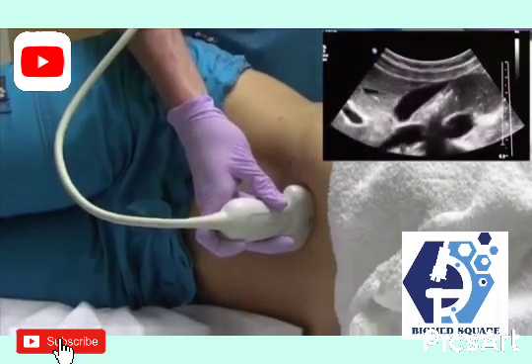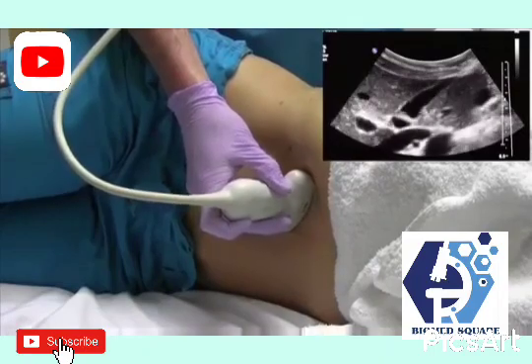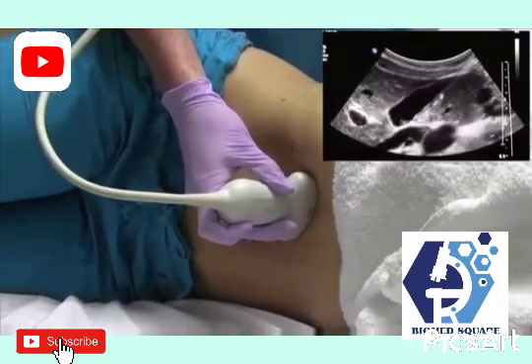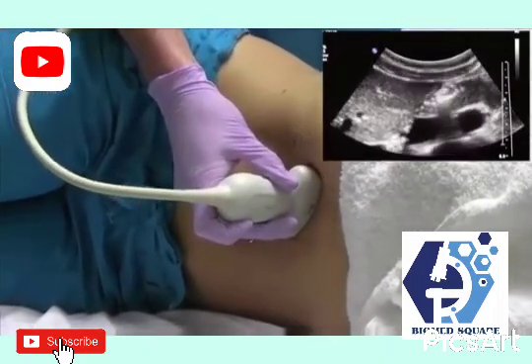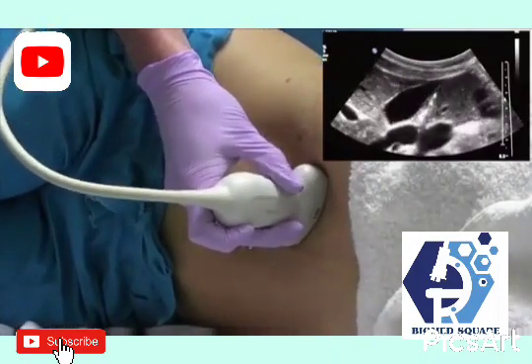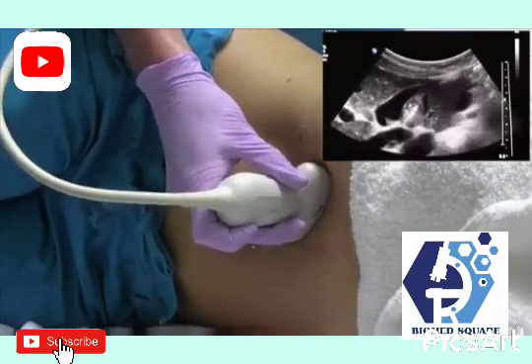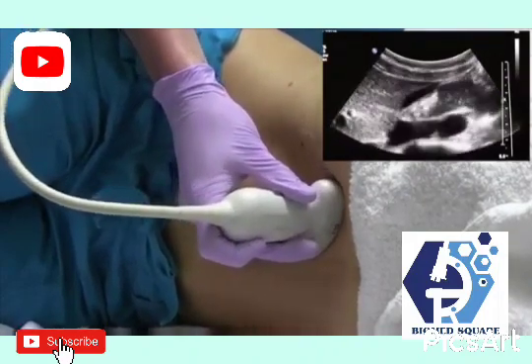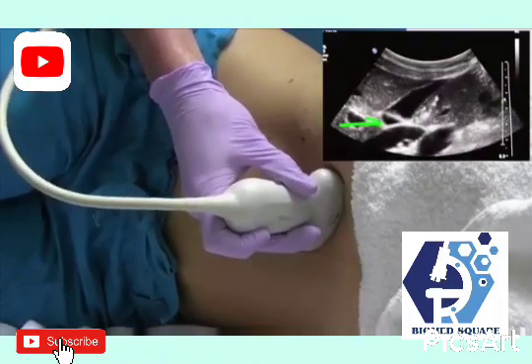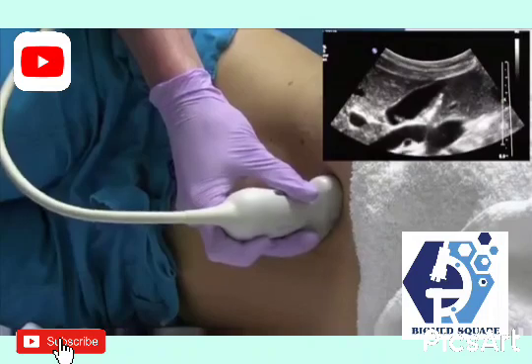And I like to start in a sagittal plane from here. You just want to make sure you sweep through the gallbladder here, and if there are any stones, they should drop into the fundus of the gallbladder from this plane here. This is also good for opening up the neck of the gallbladder to make sure there's no stones that are impacted in the neck of the gallbladder here.